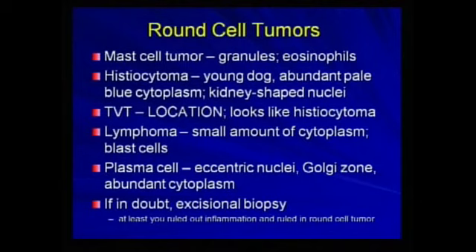Lymphomas, well, we looked at all the rules for lymphomas, but they tend to have no other inflammatory cells, no plasma cells, no neutrophils, minimal blood, and 40% or more of the cells should be blastic type, meaning they are significantly larger than an erythrocyte.